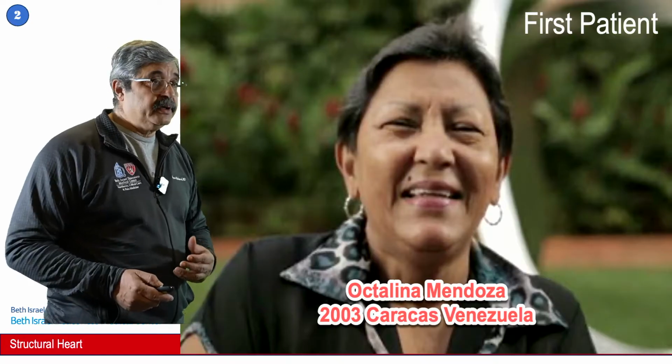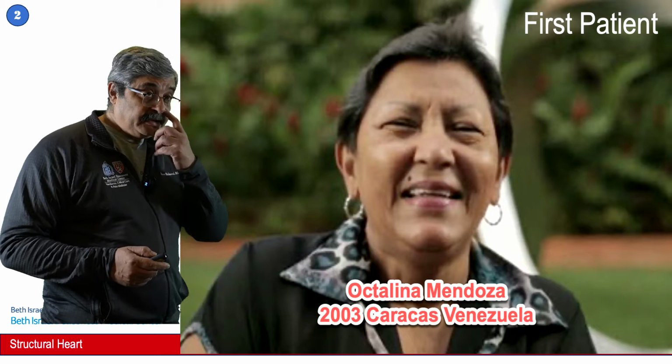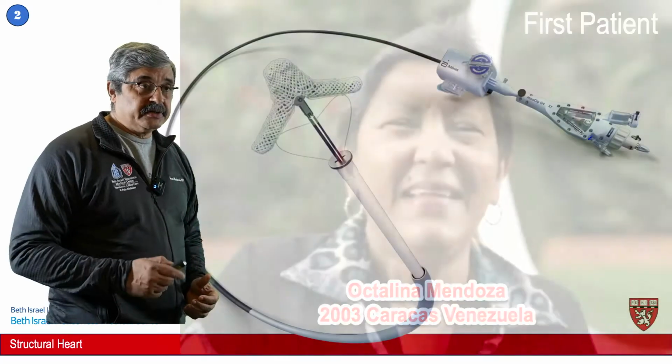So in 2003, the first patient, Octalina Mendoza, with a P2 flail, was the first one who underwent a mitral clip procedure for a P2 flail. She did very well. She's still alive, and that heralded the start of percutaneous edge-to-edge repair.